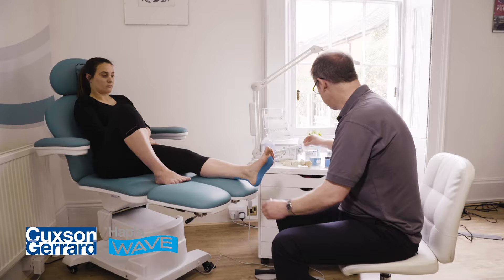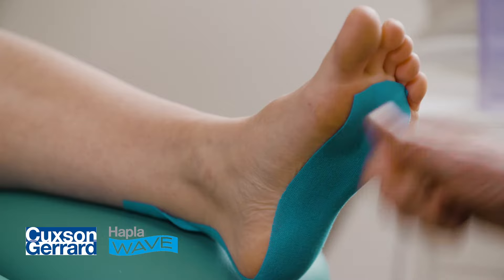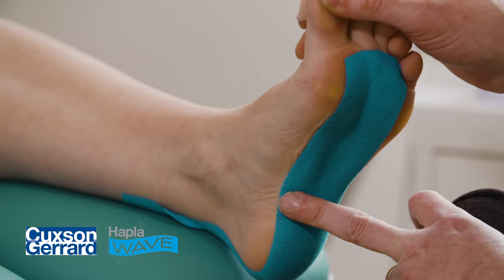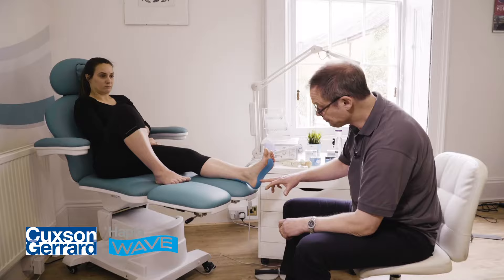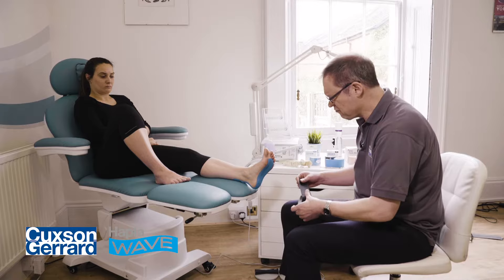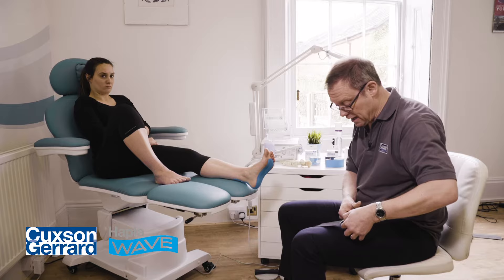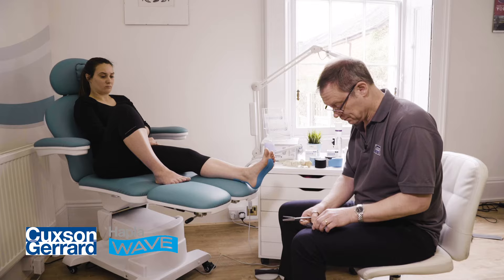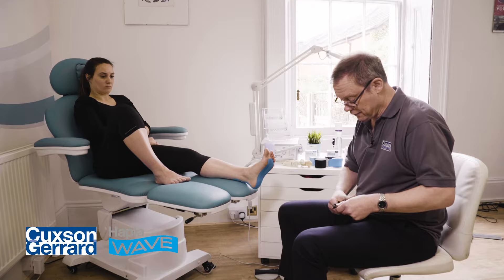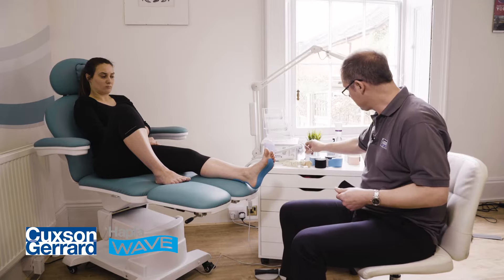Now the second two pieces are going to be applied over the area where there is the most discomfort. Generally, if we dorsiflex the hallux and we tension that medial band of the plantar fascia, often you'll find there's a lot of discomfort in this portion here — just slightly distal to its insertional point on the medial tubercle of the calcaneus. So we're going to establish, not quite at 90 degrees, two cross pieces of tape. Remember, we don't need that much because we're stretching it. This is to add maximum lift of the skin — the epidermis, dermis, superficial layer, and deep fascia — so that any inflammatory oedema beneath has a slightly larger surface area over which it can be distributed, and therefore doesn't exert such hydrostatic pressure on those small venules and lymph vessels, so they themselves can absorb that inflammatory oedema faster.